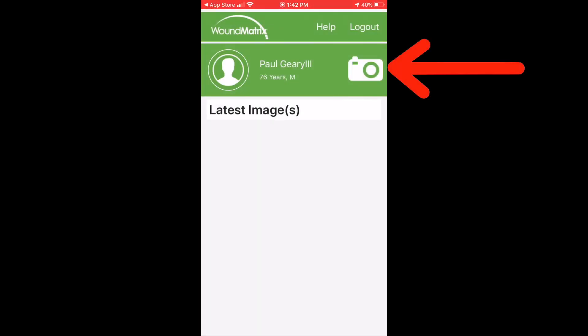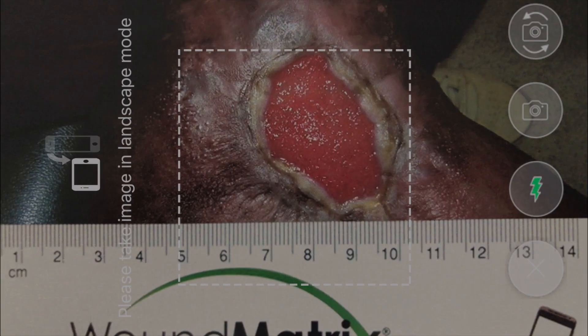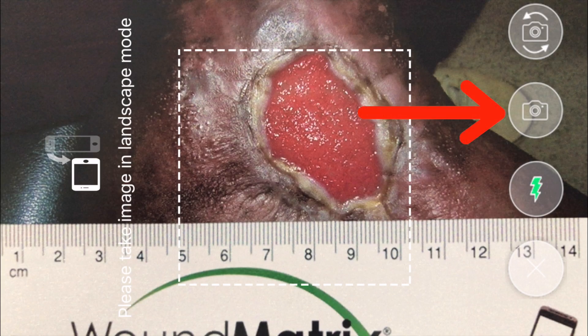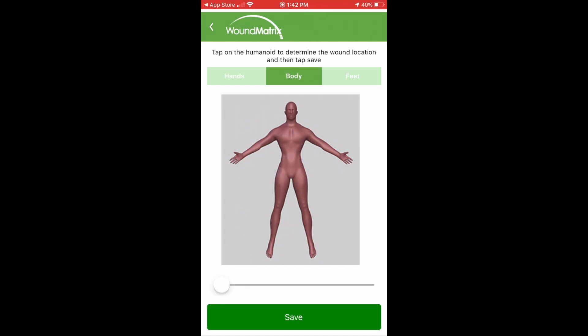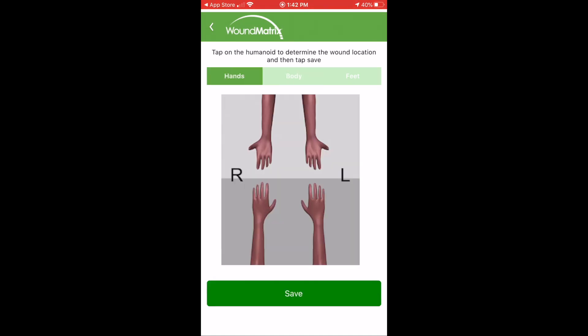Simply tap the camera icon to open the camera. Tap the camera button. A body part locator will appear.